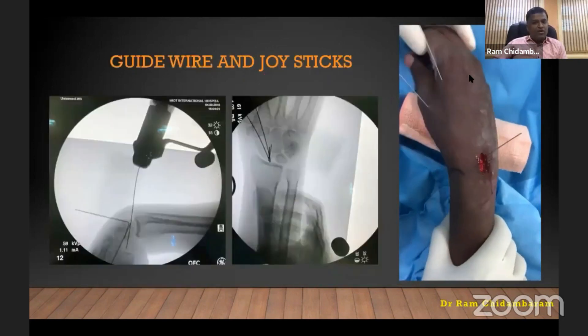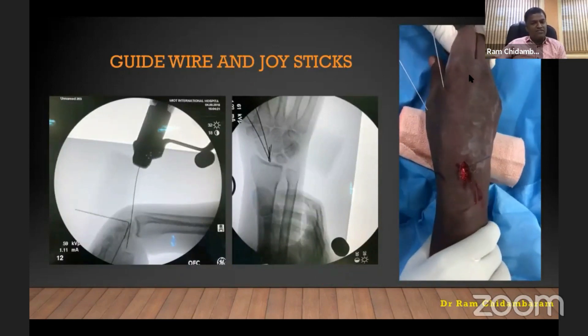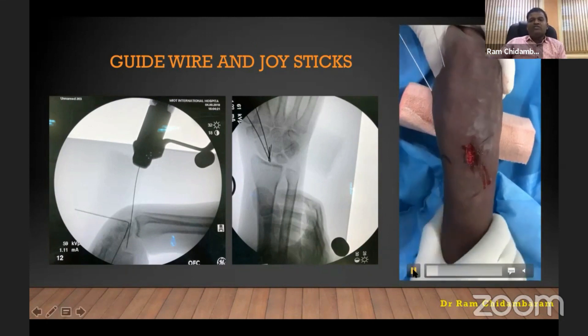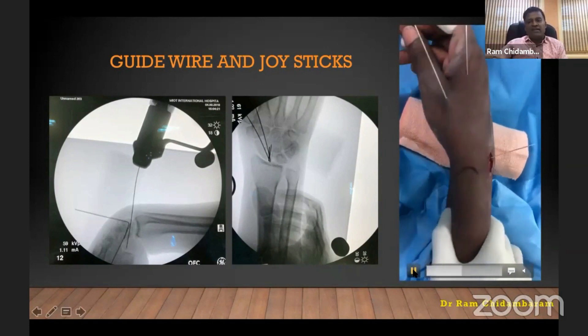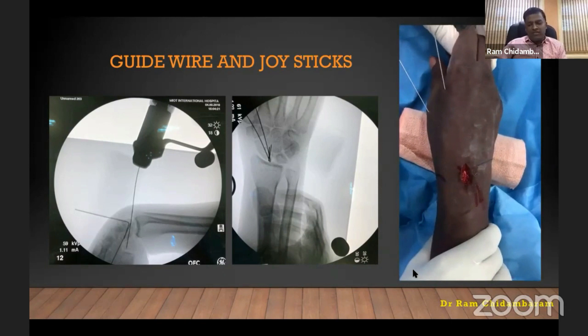Once the capsule is opened, put the wire from the dorsal approach with the wrist completely flexed and pronated. You cannot do a lateral AP view at this point. As you can see in the clinical video, the two wires are being pushed distally. The joystick wire is holding the fracture. Now do the fluoroscopy screening to make sure you are satisfied.